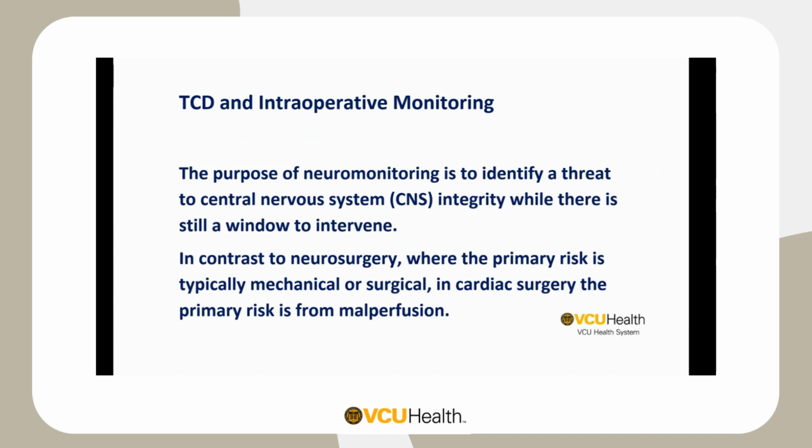Over 20 years and more, we continue to identify unexpected compromises in neurologic perfusion while conventional monitoring parameters remain normal. During bypass, the region of cerebral hypoperfusion is increased related to non-pulsatile flow.